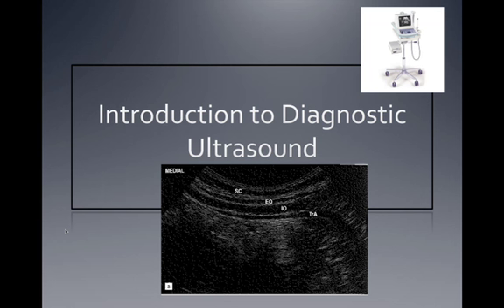Okay, let's get started. We're going to look at diagnostic ultrasound today. One of the things I'm going to point out in this cover slide, this start slide, is the image that you're seeing right here. It's a little pixelated. Trying to put any of these ultrasound images onto a computer screen is a little less than optimal. But what you're seeing right here is a picture of the abdominal muscles. And we're going to see this over and over again.